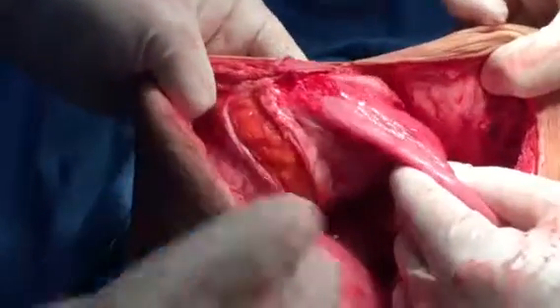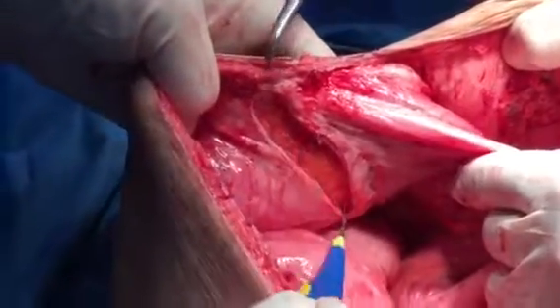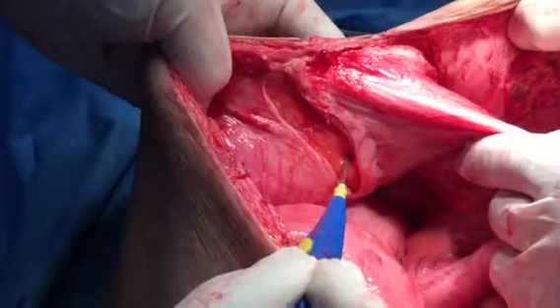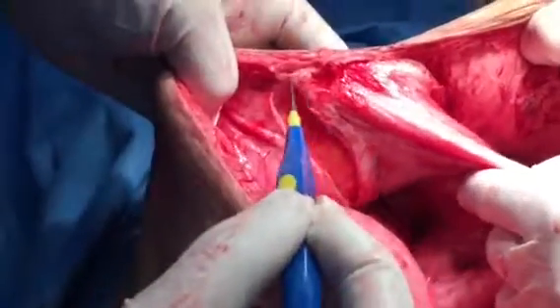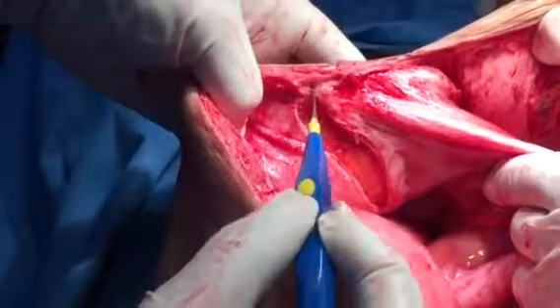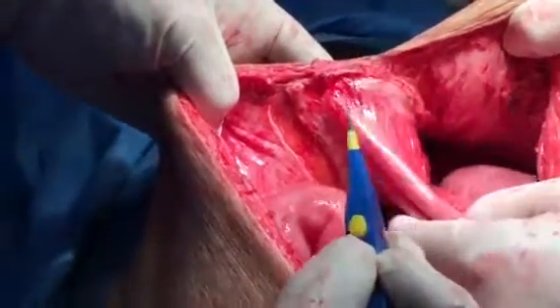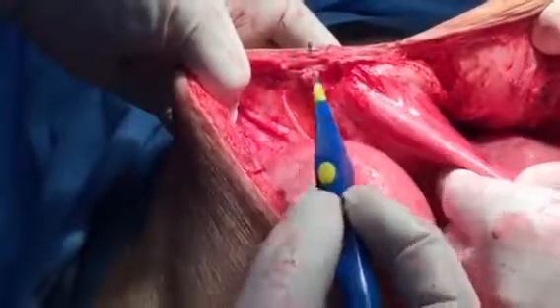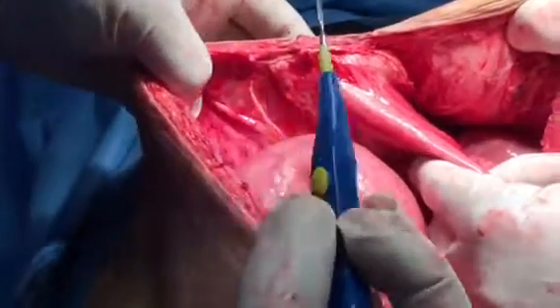Using cautery, we incise the sheath and abdominal wall. You see now — this is the sheath — and we go deep. You can even remove a portion of the skin with this and put it inside without separating it from the bowel. It has been found that even the skin causes no problem. This has been mentioned by maker.